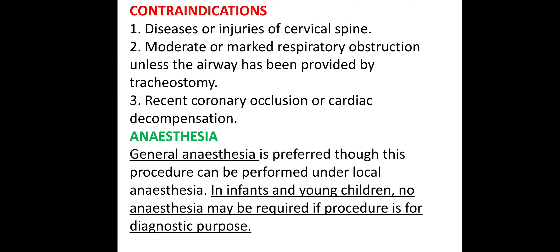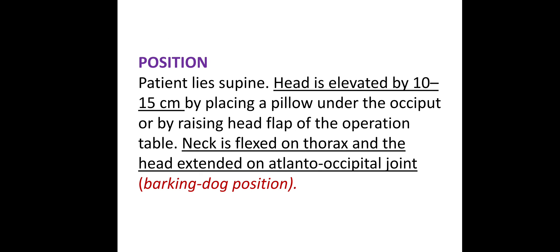Regarding anesthesia: general anesthesia is preferred, though this procedure can be performed under local anesthesia. In infants and young children, no anesthesia may be required if the procedure is for diagnostic purposes.